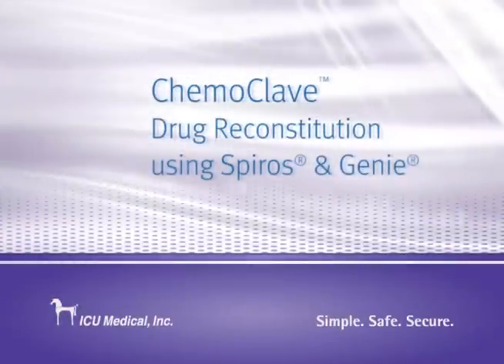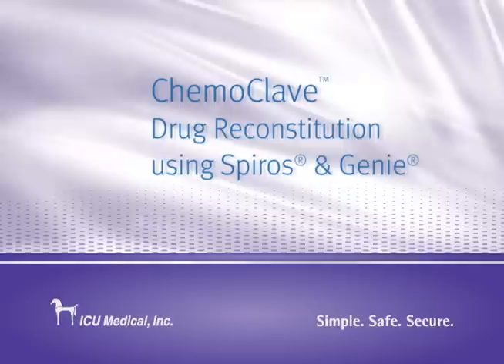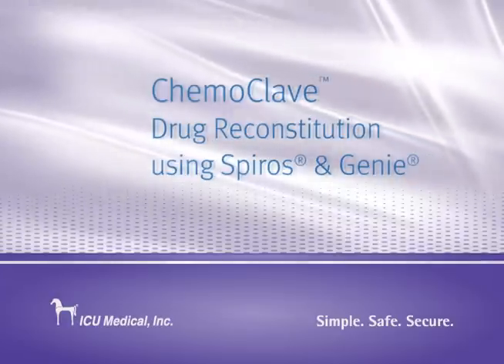The following video will describe the basic setup for using the ICU Medical Chemoclave system for handling hazardous drugs.